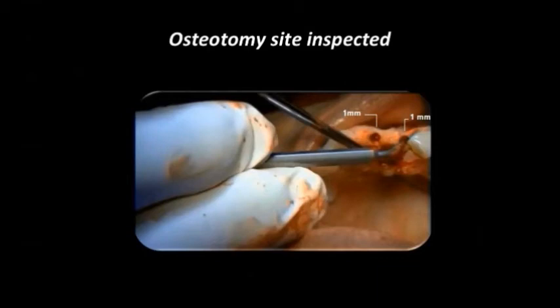I always inspect the site with this little tool, in order to check that there is no perforation, because if there is perforation anywhere and the soft tissue gets in touch with the implant, most probably you'll get a failure of the implant.